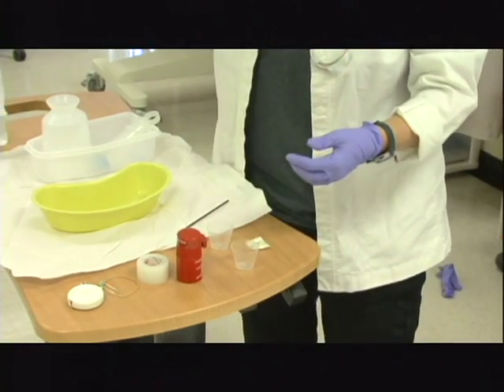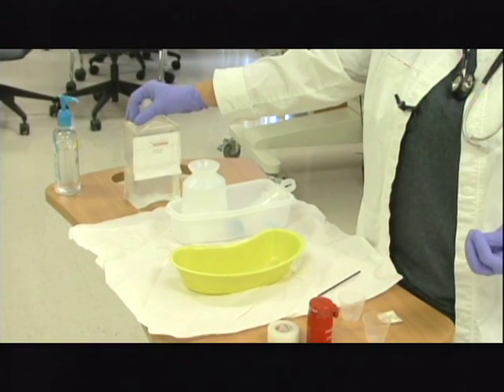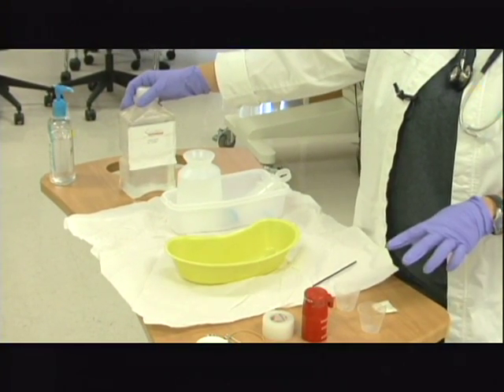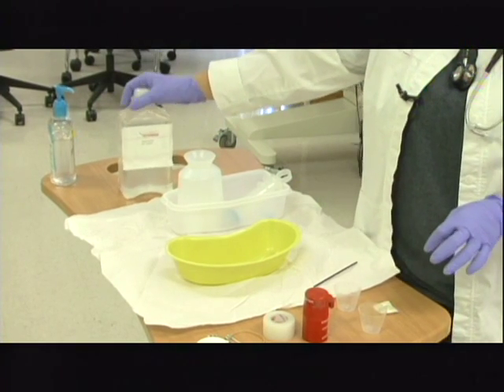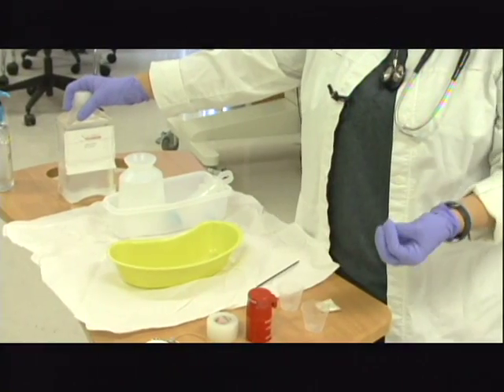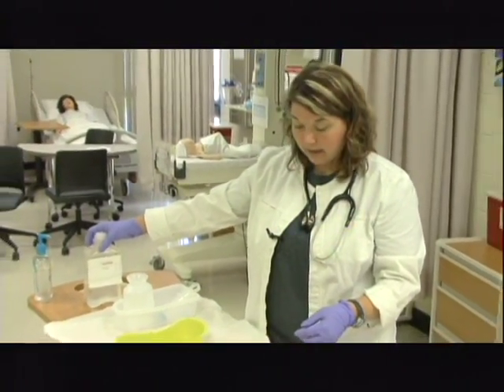I'm now going to come over and use whatever irrigant is ordered. Most of your hospital policies are going to use tap water, both for the irrigant and to mix the medications. But please make sure you check, because some agencies will require sterile water, and you don't want to give your patient too much free tap water. You could alter their fluid and electrolyte status. So always make sure that you check back on that.